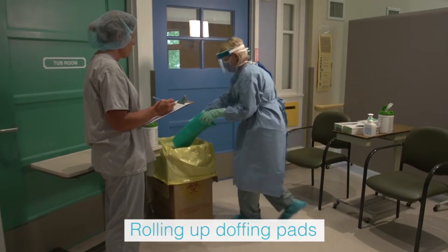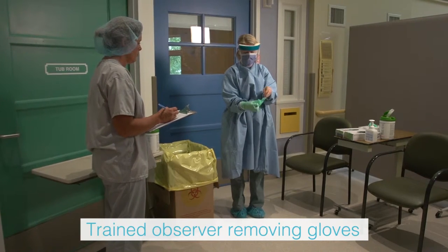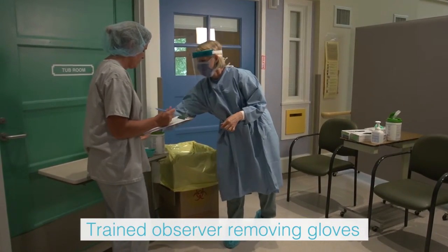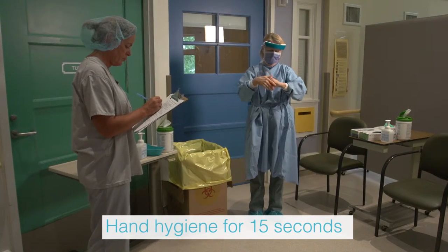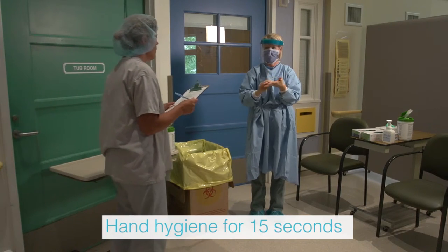The trained observer removes the inner glove by grasping the outside edge near the wrist and peeling away, rolling the glove inside out. Slide one or two fingers under the wrist of the remaining glove and peel away. Discard immediately into the waste receptacle.